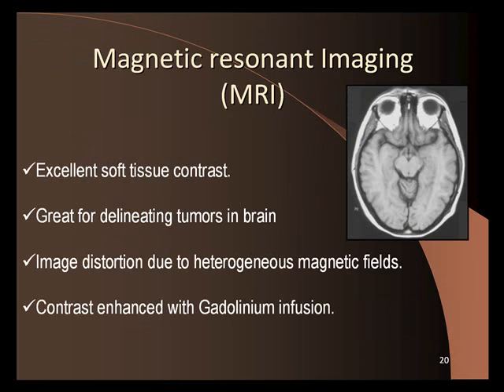Okay, MRI. We talked a little bit about MRI and introduced it to you. So just some basic points about it. This is an MRI image. How can you tell it's not a CT image, just by looking at it? Do you know?